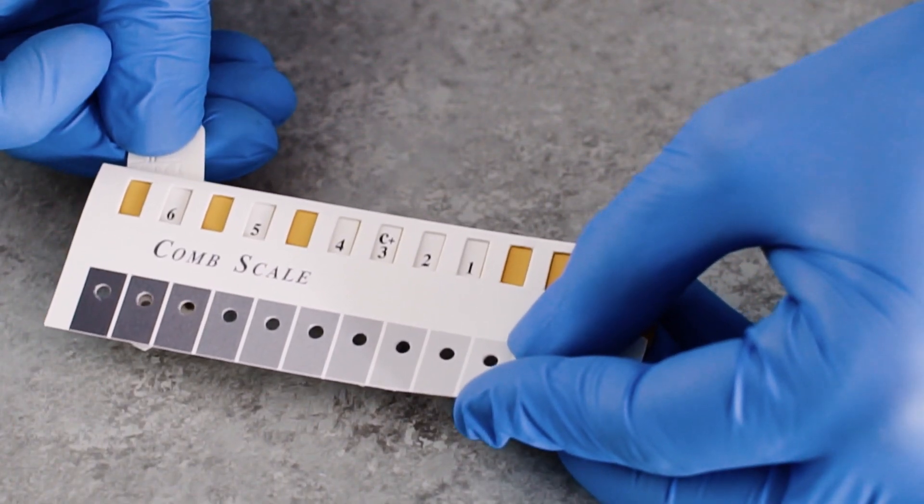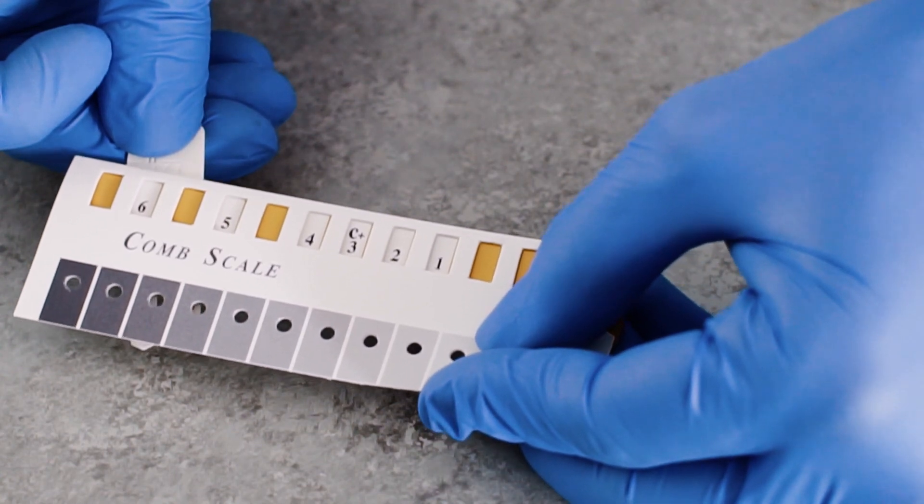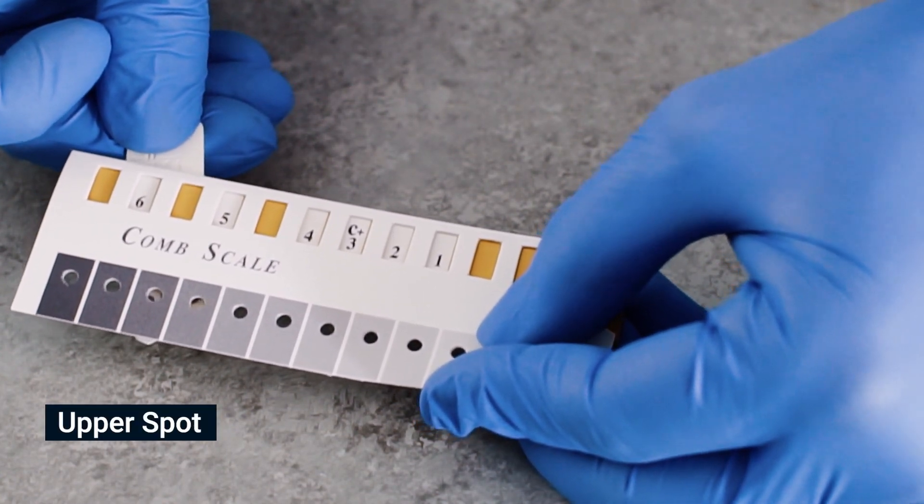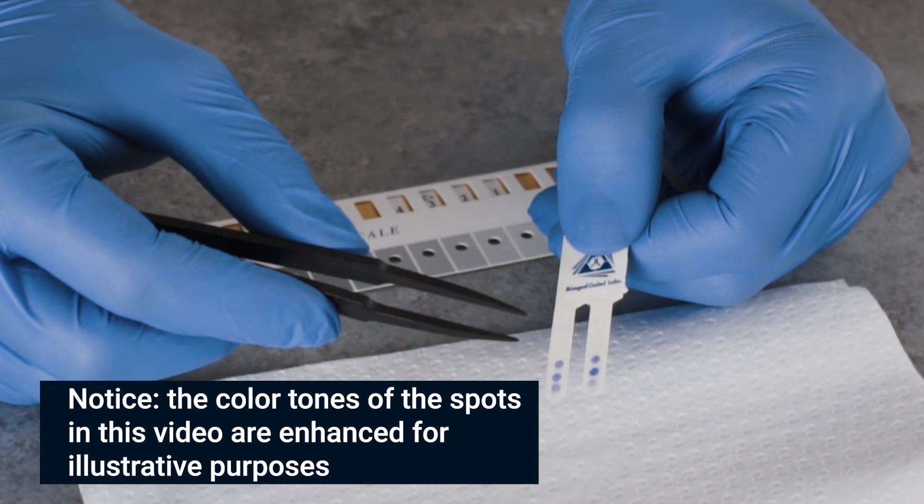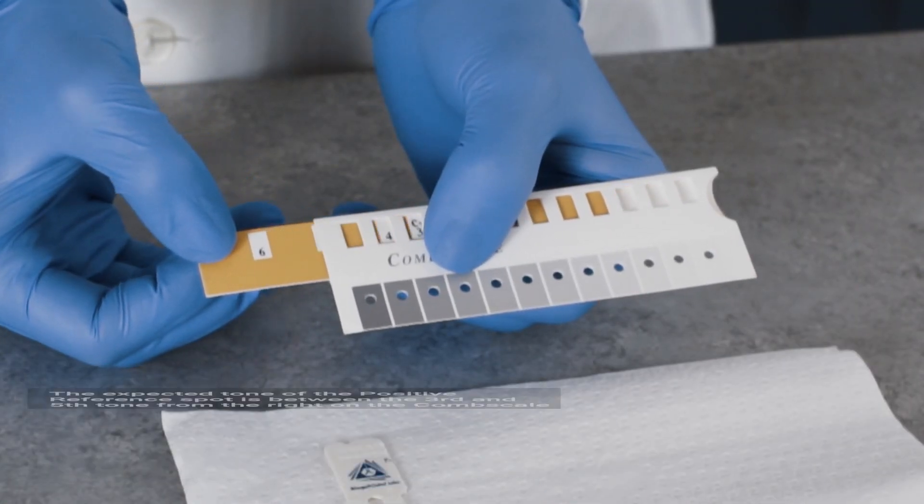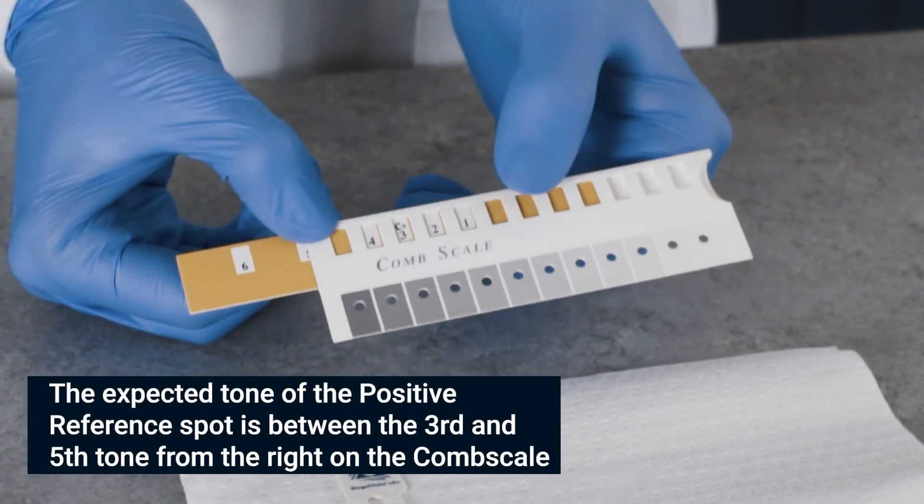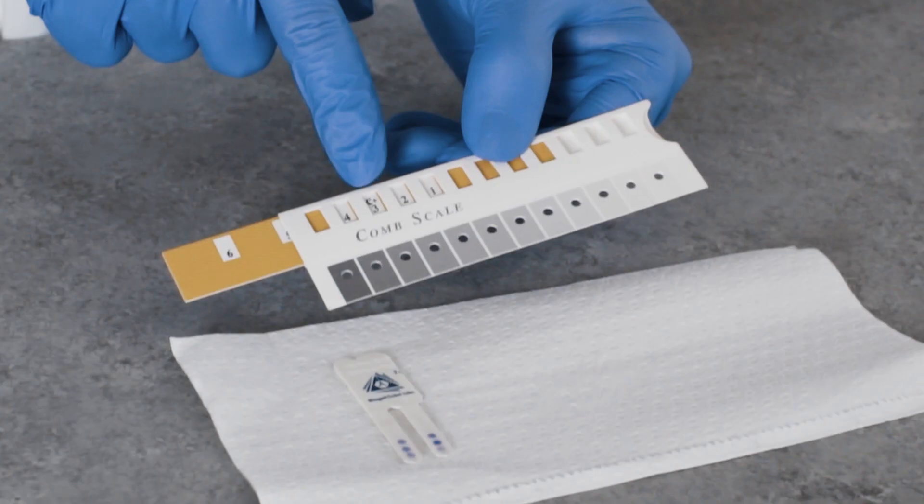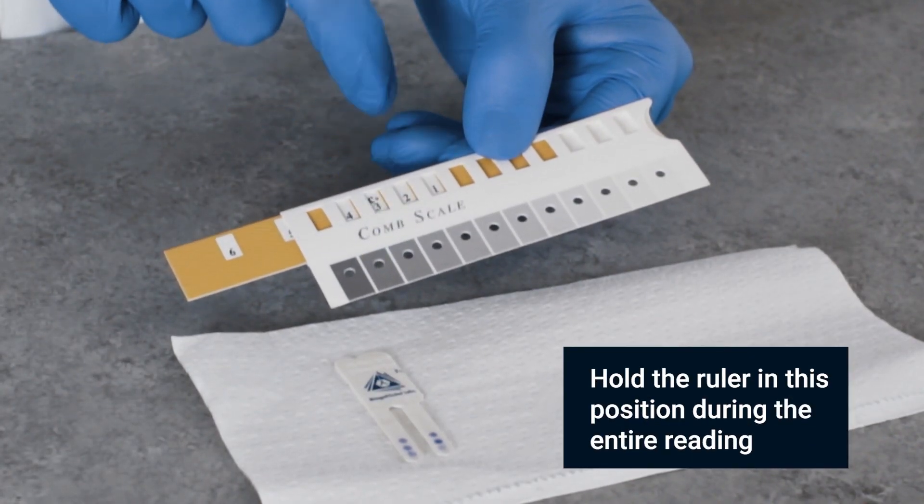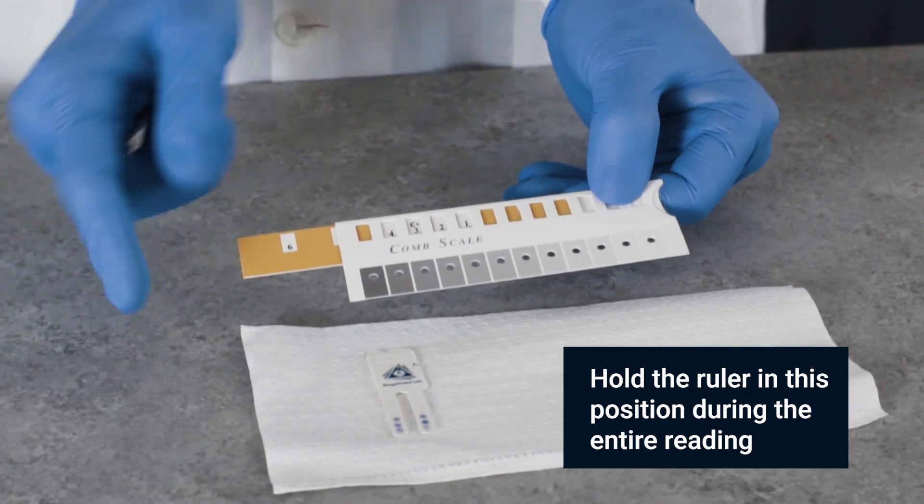Find the tone of purple-gray on the comb scale that most closely matches the positive reference spot. Slide the yellow ruler until the C+ mark appears in the window above the color you just found. This calibrates the C+ to S3, which is the cutoff point to which test spots will be compared.